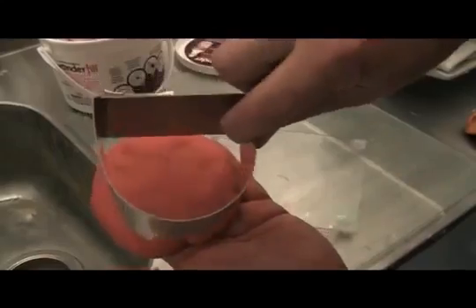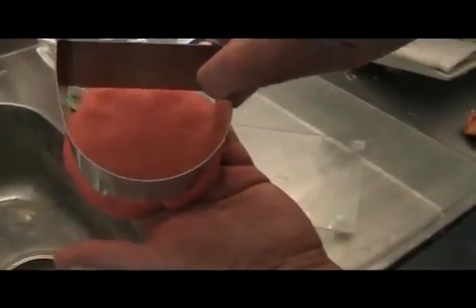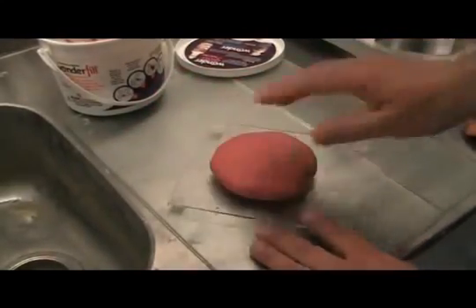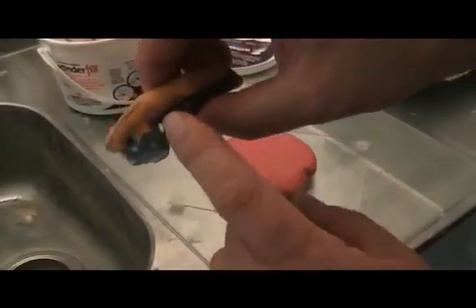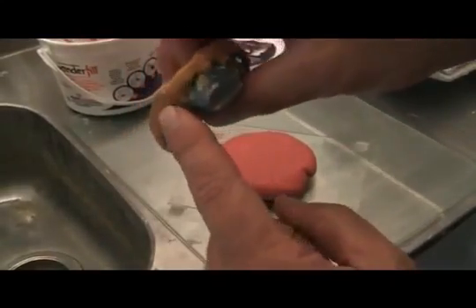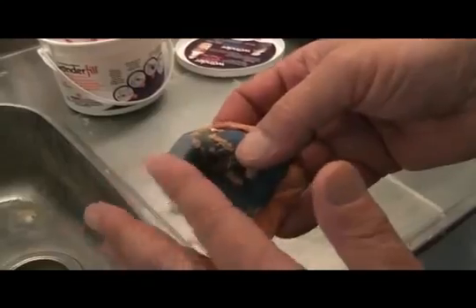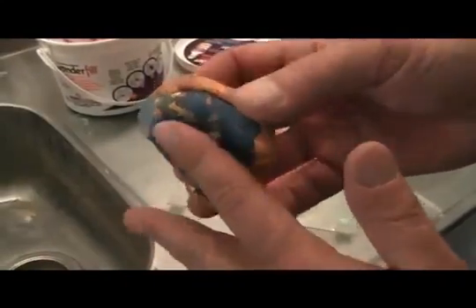Generally, I take the former and place it over the patty to make sure that it basically encompasses the size of the former, which it does. I place it on here like this, and then I take my impression, which I have already marked the depth of the sulcus on, so I know exactly how deep I want to press this into the Wonderfill material. And I've also cut off the handle so it doesn't get in the way, and so I can press the impression tray down into the Wonderfill adequately.